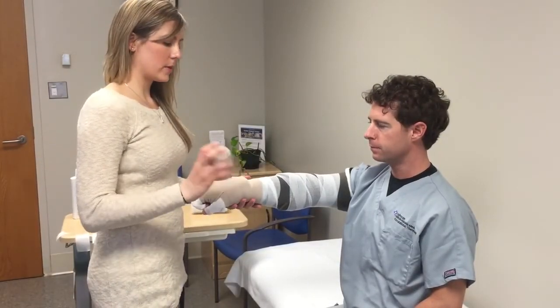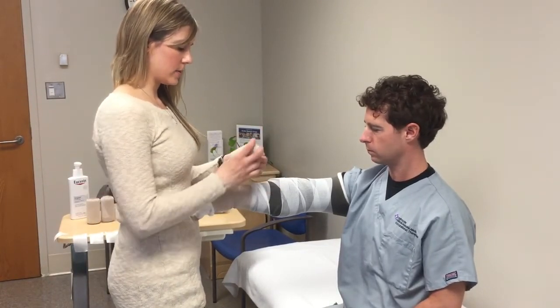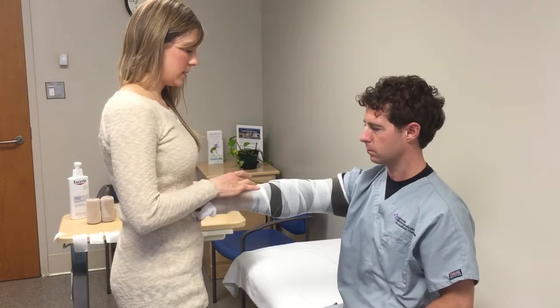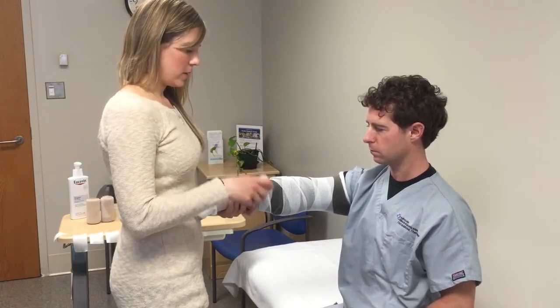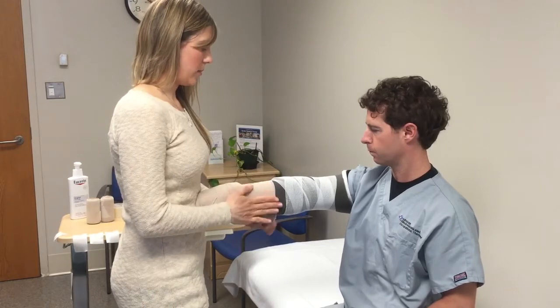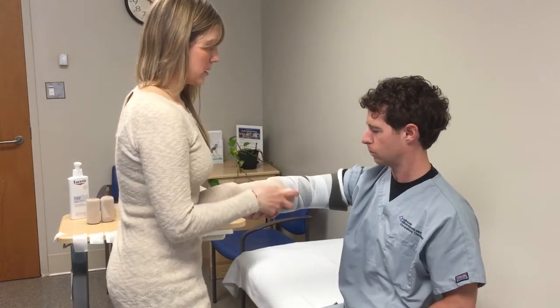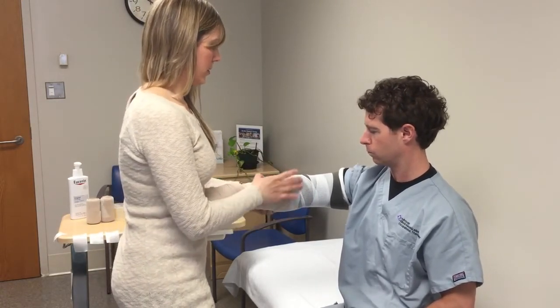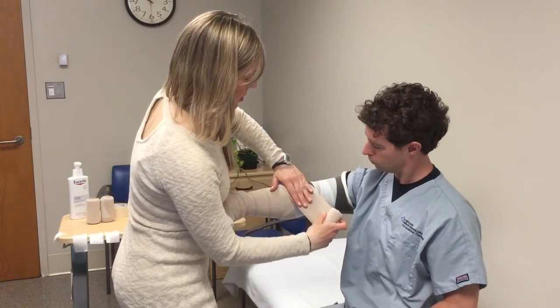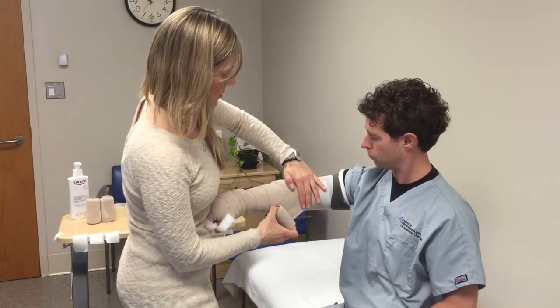Now that the hand is complete, start with your next bandage. You can have the patient gently push into your belly to help stabilize the arm and engage its muscles. Start by anchoring at the wrist, pulling gently and spiraling up, covering about 50% of the last spiral. Work your way up to the elbow where you'll create an X in front of the elbow. Come around and go up across the biceps or upper arm and then back down, so you've created an X here.